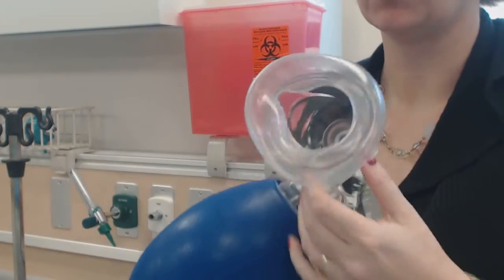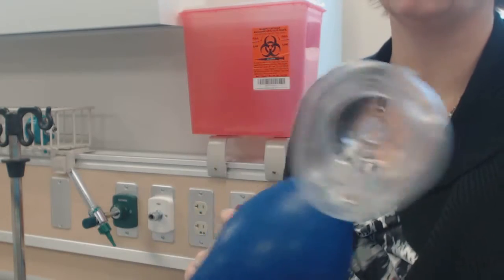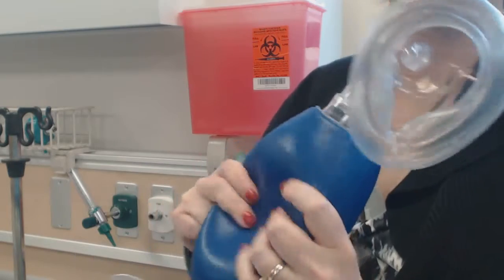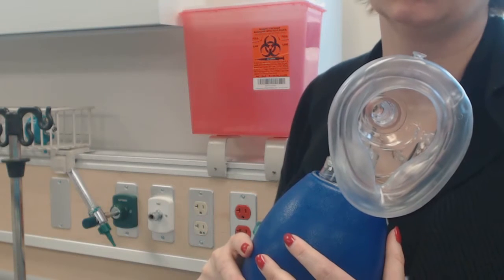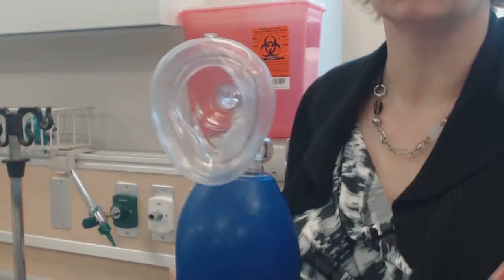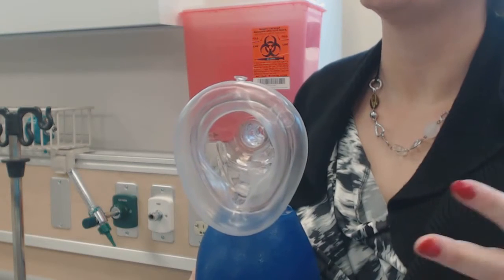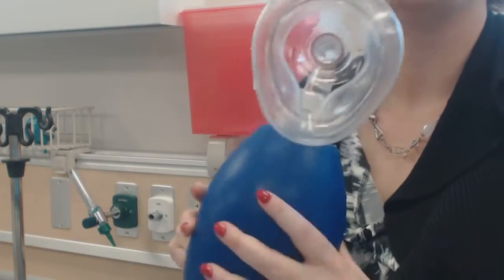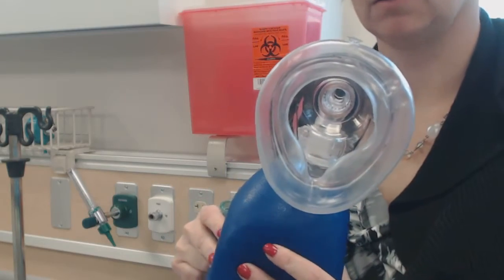When we use this, the patient may or may not be conscious and we are assisting them. If they still have their own respiratory effort, we assist when they take a breath in — we aren't going to force the whole thing in. With a COPD patient you might actually cause a pneumothorax because their lung tissue is more friable. Similarly, with an infant or toddler, their lung tissue is frail. You don't want to force a huge amount of air in; you want to support their respirations and give them what they need.